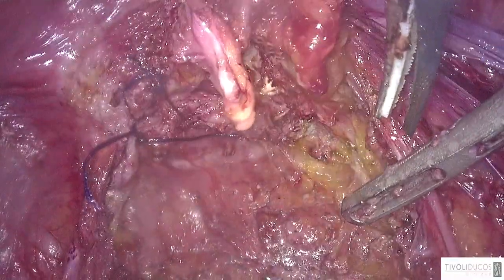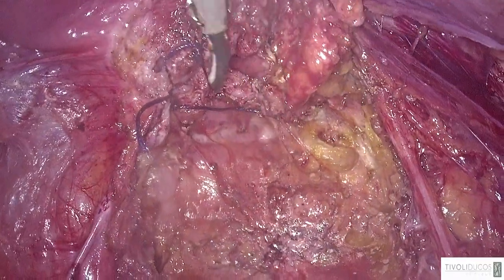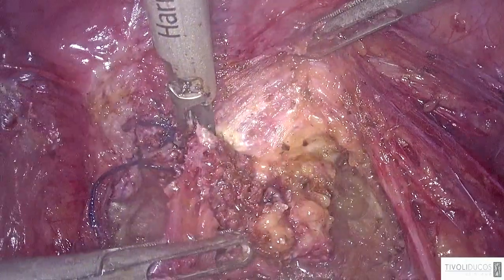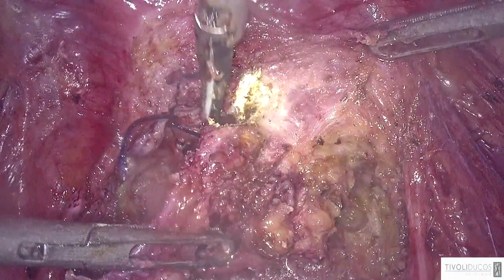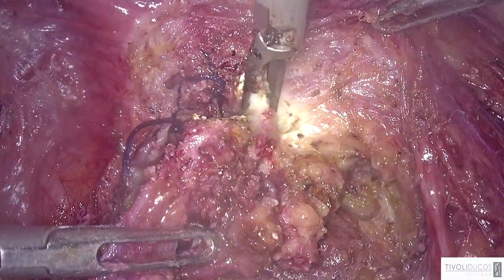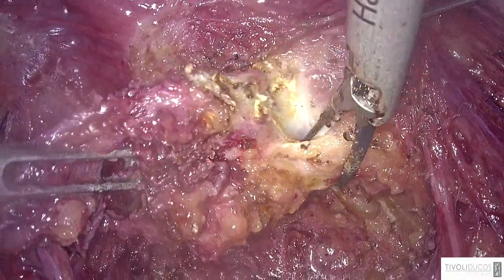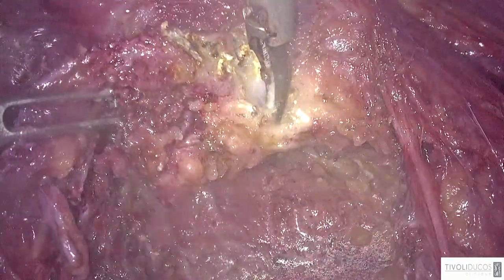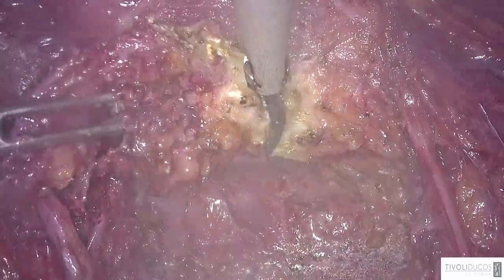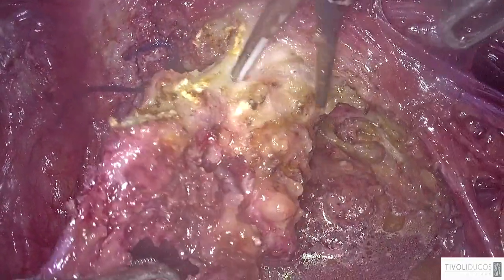Move on. And now this is the lateral part of the nodule, in connection with the vagina. You see the vagina is here, so I think we can cut it here, because here will be the paravagina. And here we are joining the vagina. So here is the paravagina, but here we no longer have deep endometriosis, because you see the tissue looks healthy. Okay, let's finish with this.